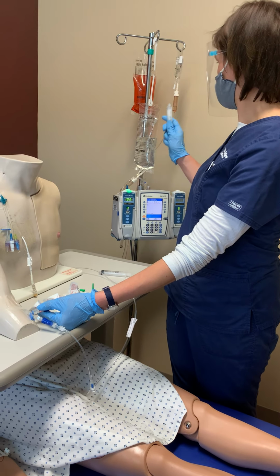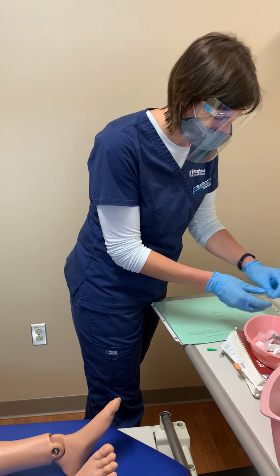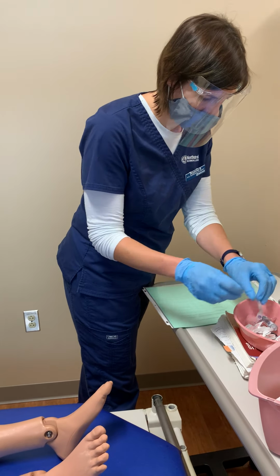This is something that you do with the pick specifically, because there is just so much catheter. Okay. I'm going to clean up my mess. I'd put the appropriate things in the garbage. If there was anything blood stained, I'd deal with that in the biohazard, but we're good there. So, let's see. This stuff is now in the garbage.